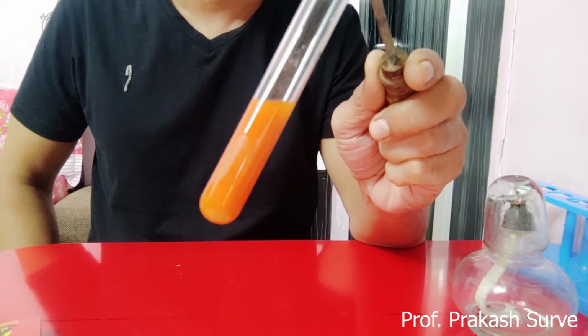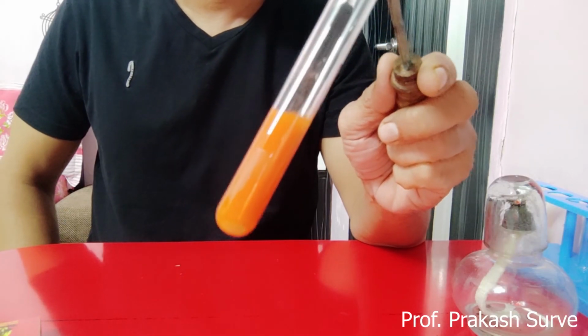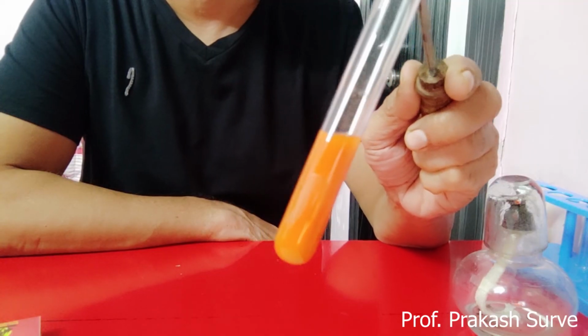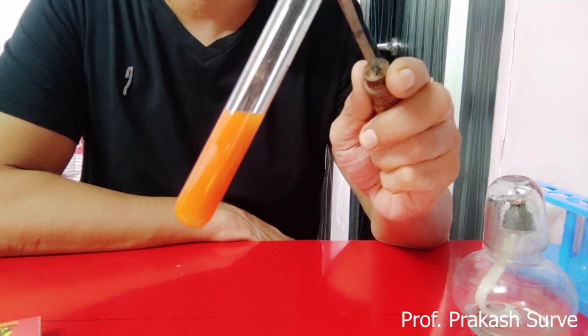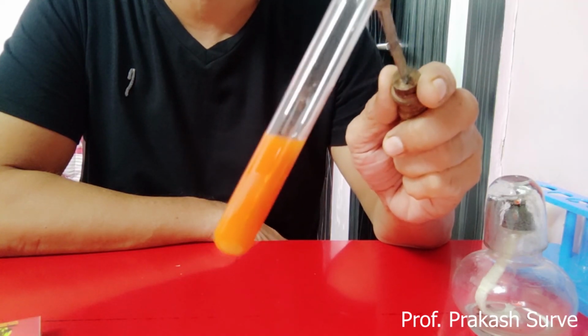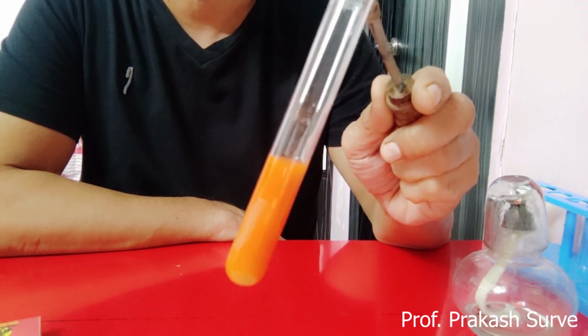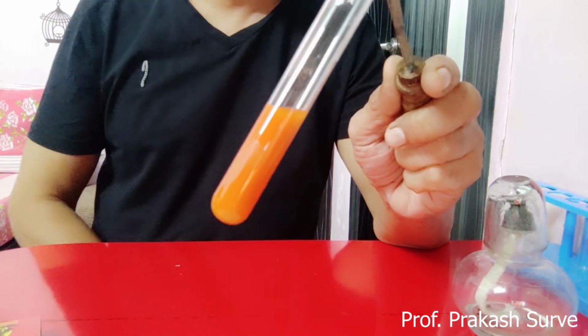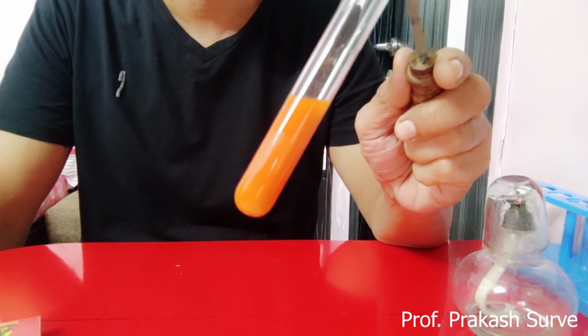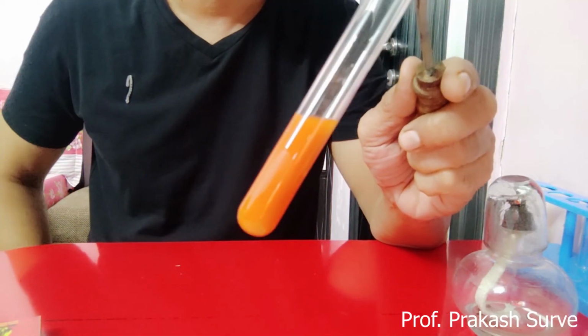So here in this result, what we got? The positive result. So of the tests we have performed, presence of urea is considered normal, but the presence of sugar, presence of bile, presence of albumin, all these urine samples are considered abnormal. Okay, so we have performed this to understand the normal and the abnormal content in the urine sample.